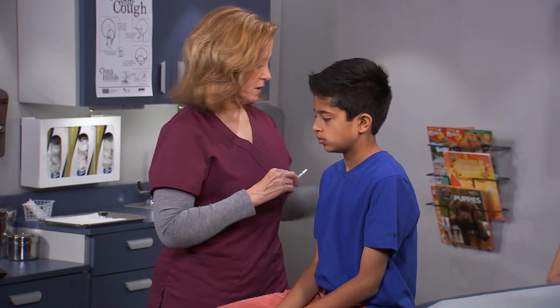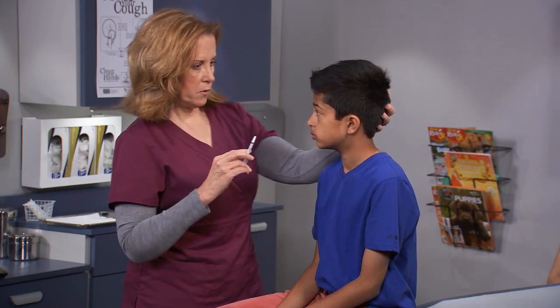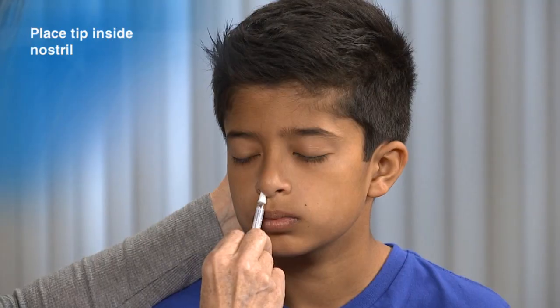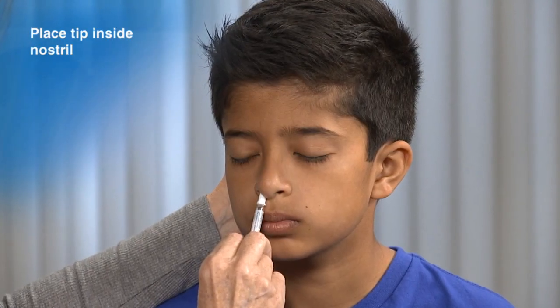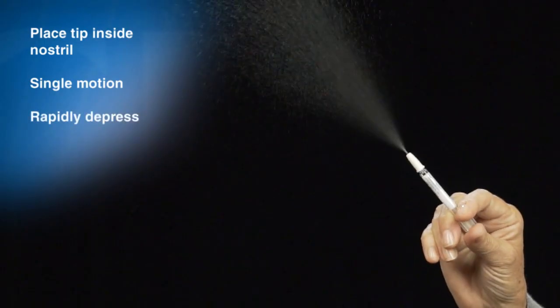Next, remove the rubber tip protector. To help prevent the patient from moving their head, the provider can place their hand behind the patient's head when administering the vaccine. Place the tip of the sprayer just inside the patient's nostril. In a single motion, rapidly depress the plunger to create the fine mist necessary to administer the vaccine.